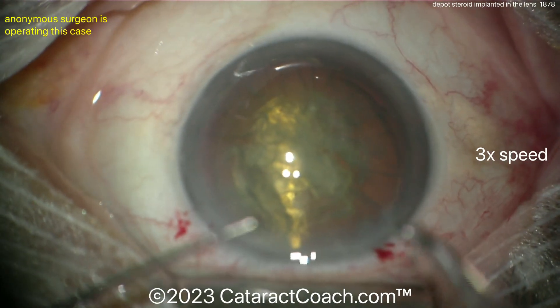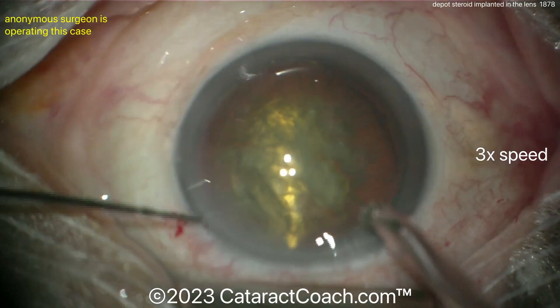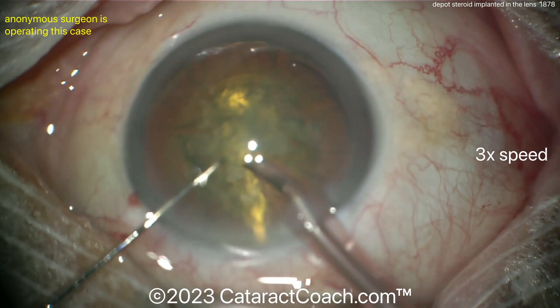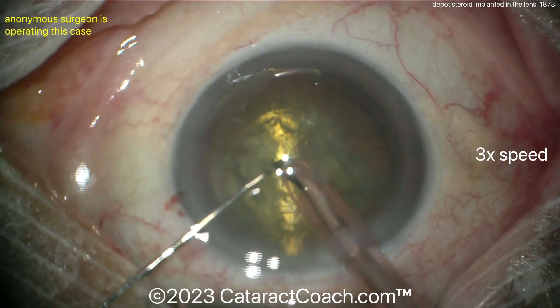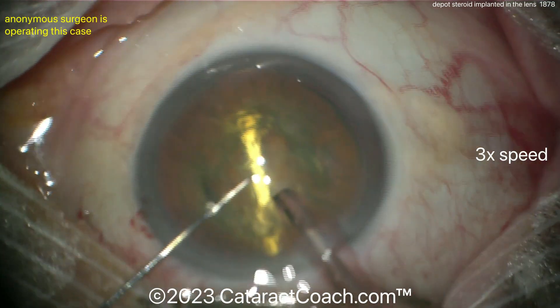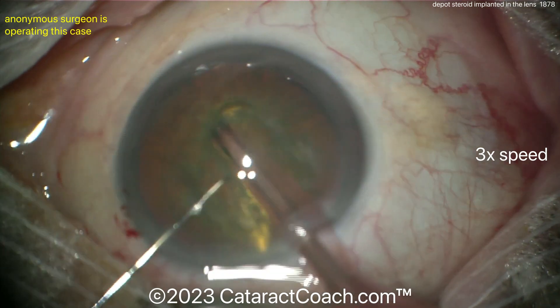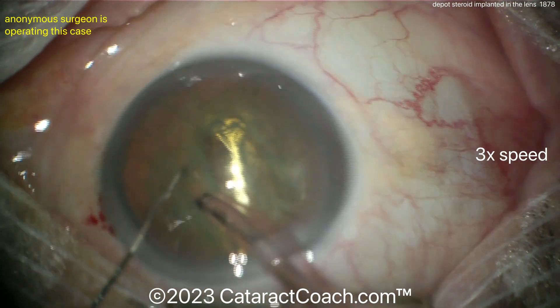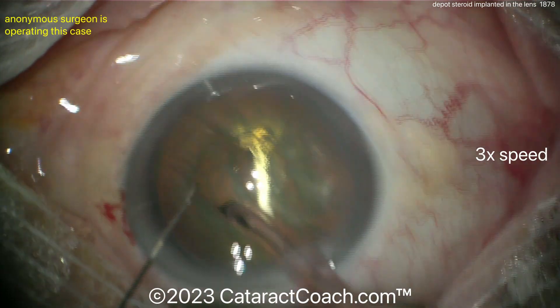I'd still take that implant out right now before proceeding. The phaco probe is being placed in the eye and taking down lens material. Can you phaco that steroid implant? Maybe — I've never tried; I've never been in this position before.